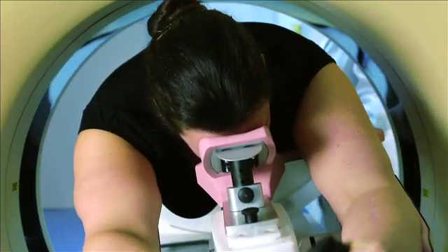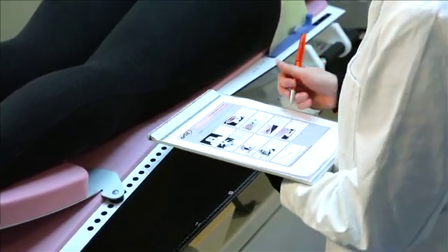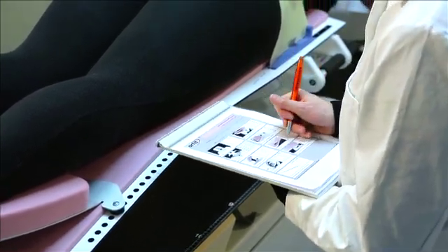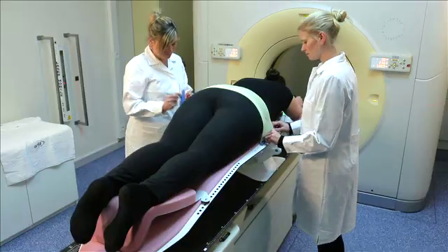When the scan is finished, mark the position of all the support structures in the patient's file. Leave the mask for a minimum of 10 minutes on the patient before removing it.